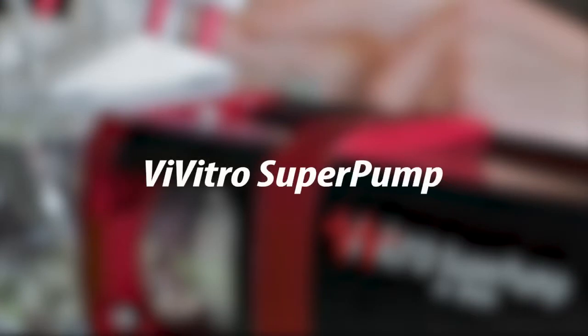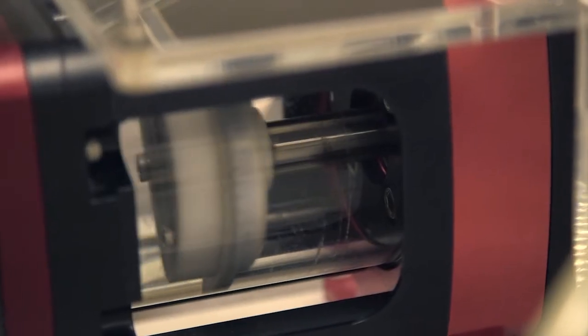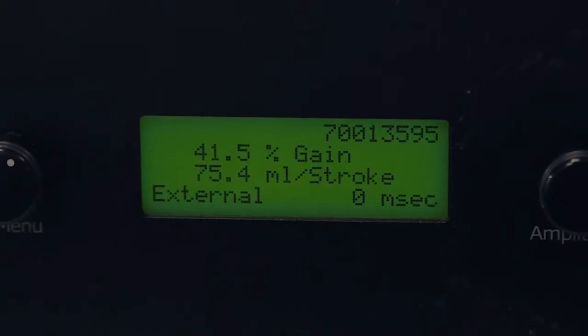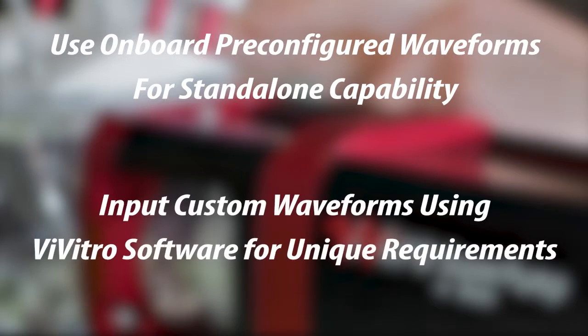The Vivitro Super Pump is the most widely used and cited pump for creating cardiac flows. The Super Pump utilizes the latest digital technology to provide maximum control with precision and accuracy. Use the onboard pre-configured waveforms for stand-alone capability or input custom waveforms using Vivitro software for unique requirements.